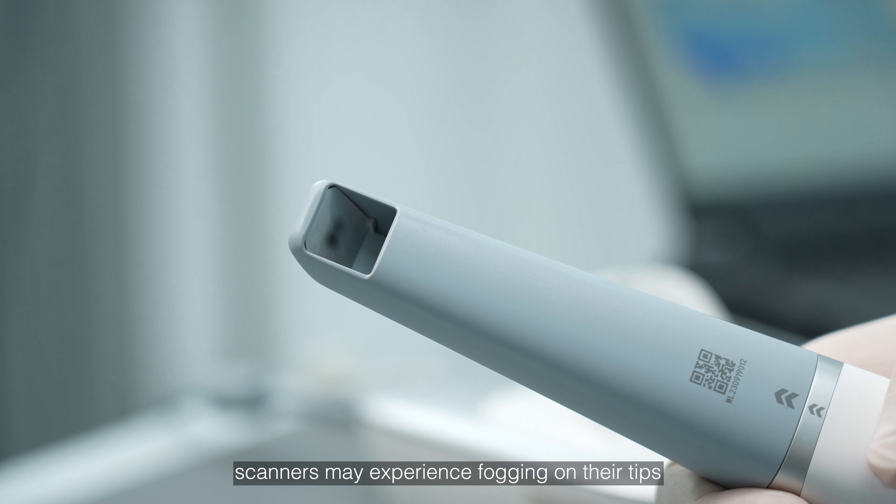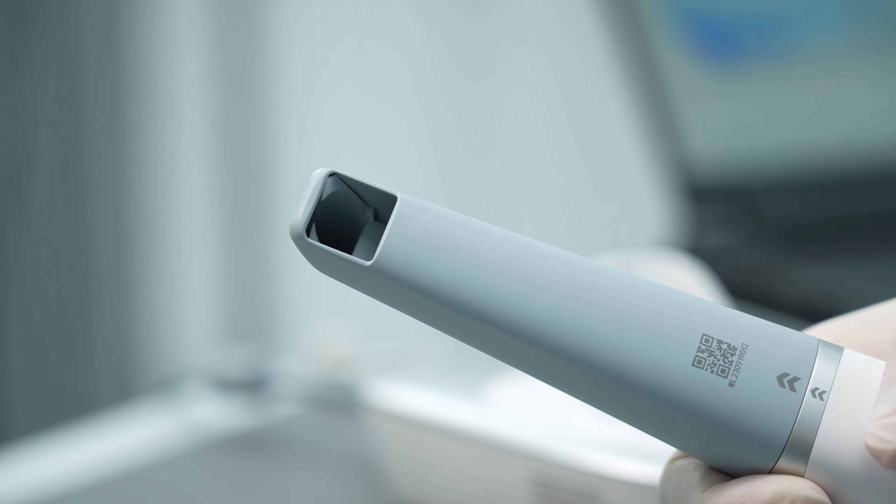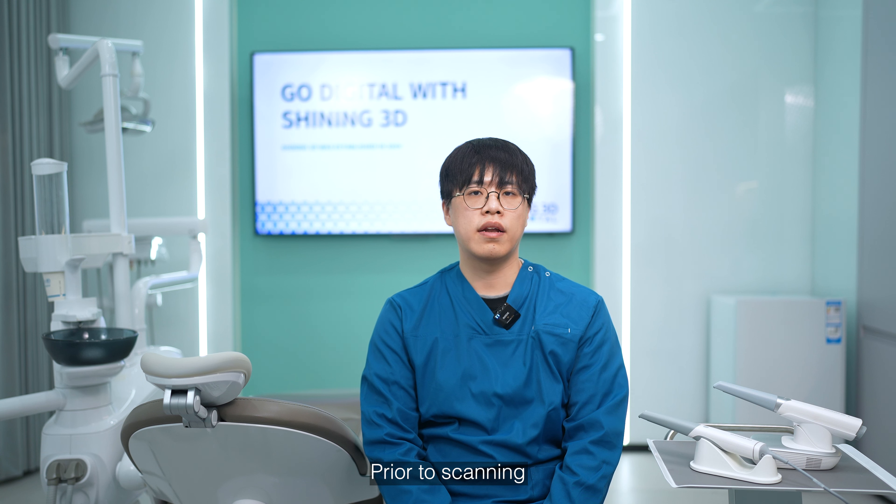As we are all aware, scanners may experience fogging on their tips when used in cold conditions. Therefore, it is essential to prevent or quickly eliminate this fog during the scanning process. Prior to scanning, follow these steps to warm up the scanner tips.